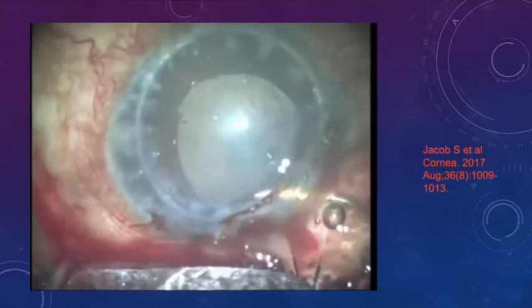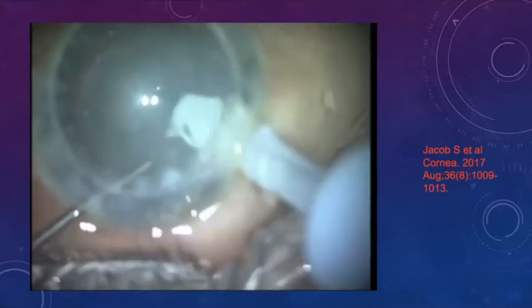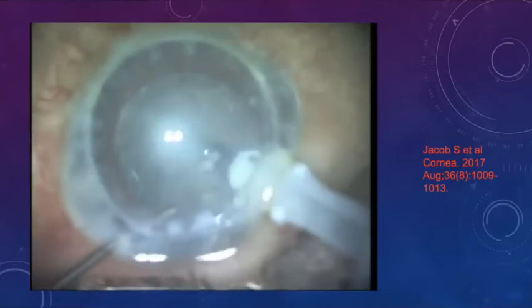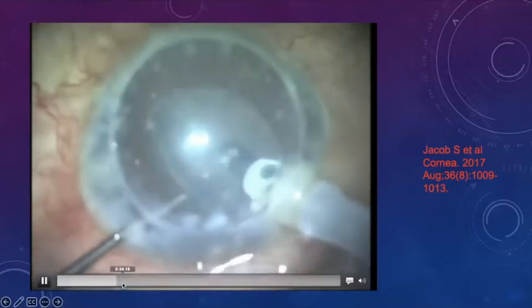So there are multiple factors which make the surgery more complex. One, you're combining it with another surgery, and second, it's already a failed graft. So obviously the curvature differences that exist can cause problems. But because it's PDEK, we are very comfortable now.